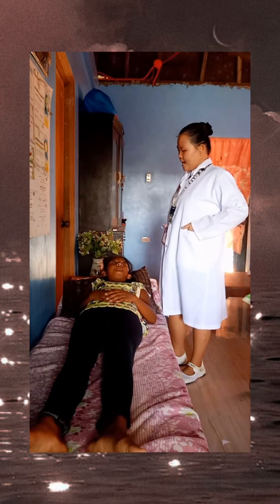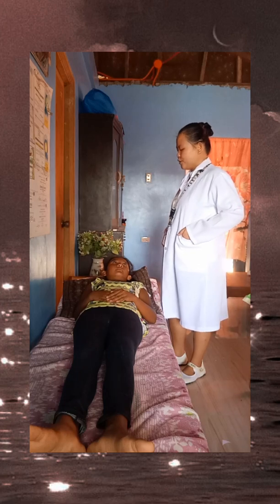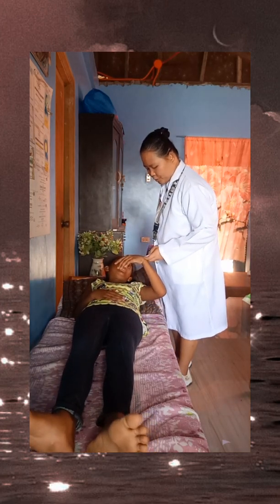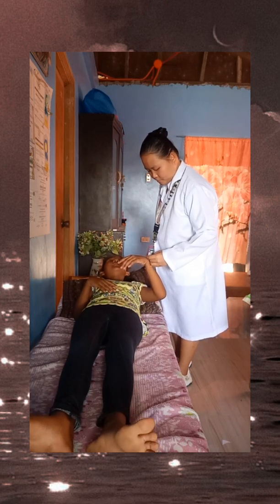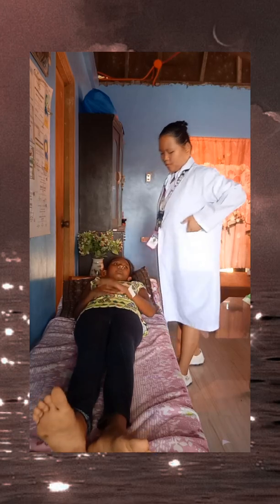Good day, ma'am. I am Joana Ivy M. Ramos from DSN2 Block B. Your student nurse for this time, and for today I will be performing the Foley catheter insertion. So, may I know your name, ma'am? Silaita Manolo. And your birth date po? December 16, 2001. Yes, ma'am. Okay, thank you.